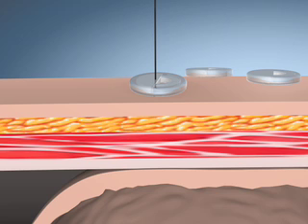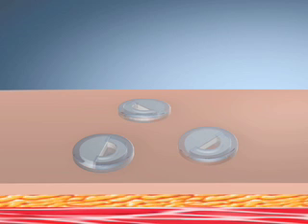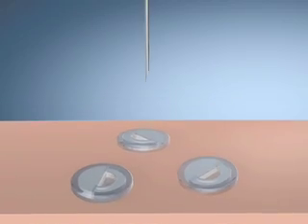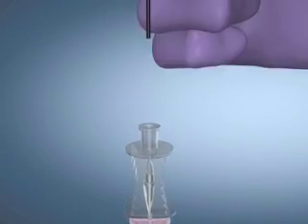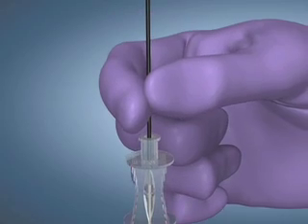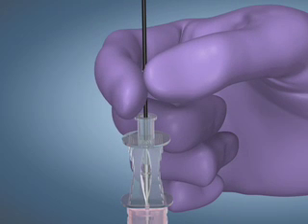Creating the stoma tract. With the stomach still insufflated and in apposition to the abdominal wall, identify the puncture site at the center of the gastropexy pattern. Insert the safety introducer needle into the gastric lumen. Advance the J guide wire, J end first, through the needle into the gastric lumen and confirm position. Use fluoroscopic visualization to verify correct needle placement.